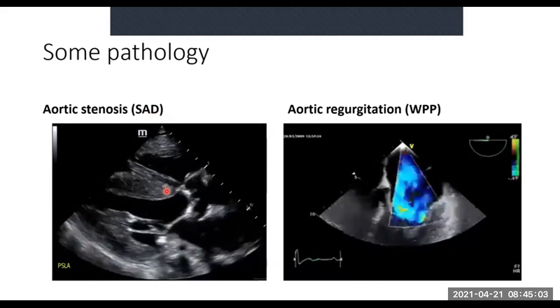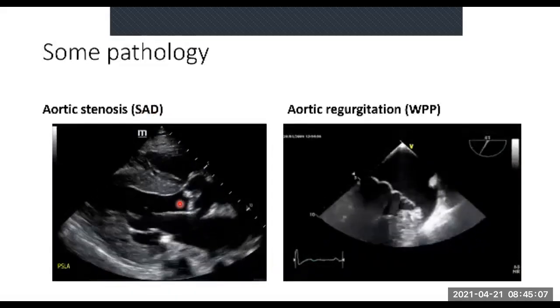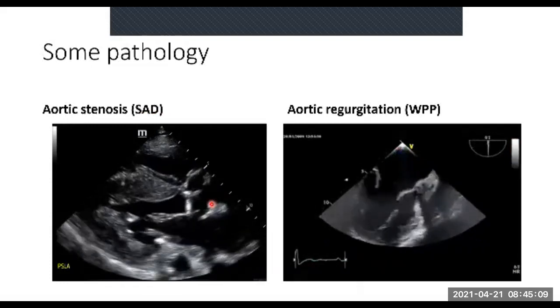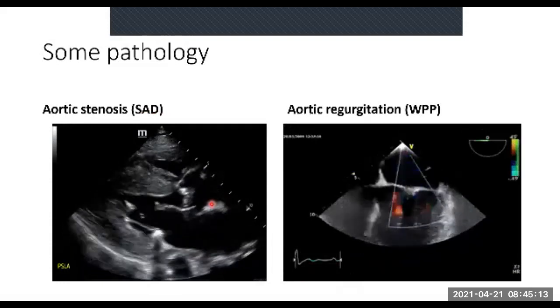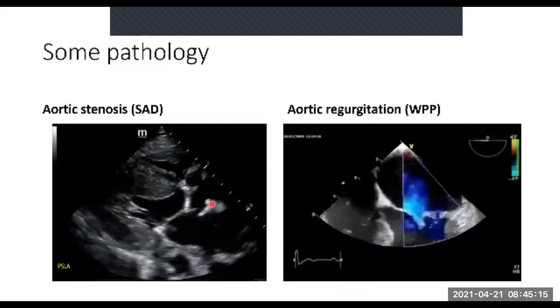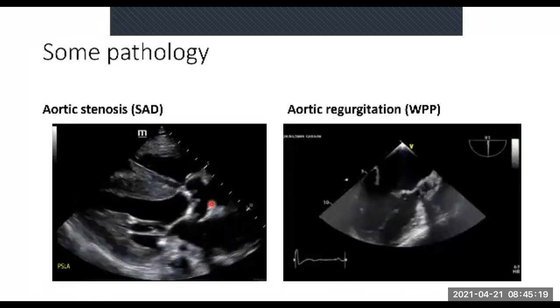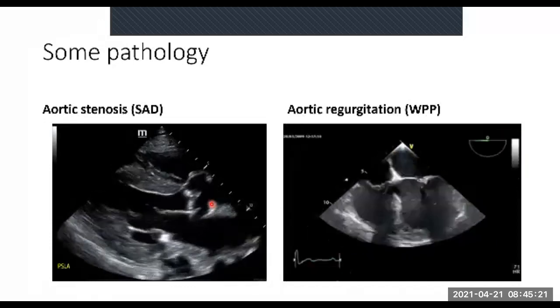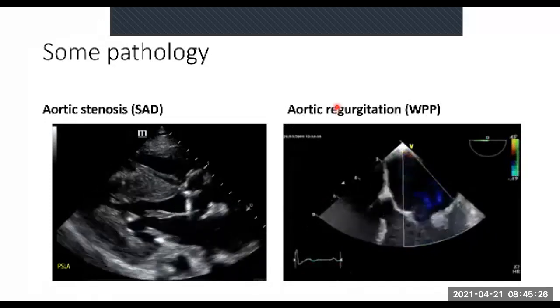But basically, you're not receiving enough blood into your aorta, all right? So what happens is your patient has syncope because quite honestly, they're not receiving enough blood. You'll figure out the other 2 and you'll let us know, okay? Can't give you everything. It's not a spoon feeding session, okay? And then you have aortic regurgitation, all right?